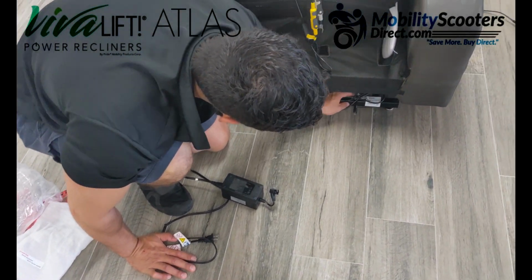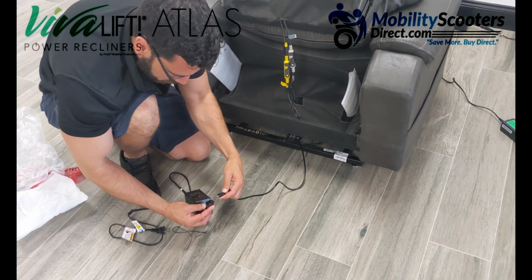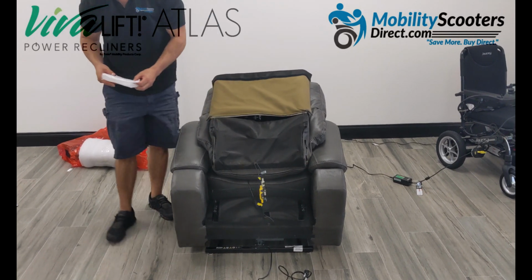It's only meant to be used to get you out of the chair in the event that there's a power outage. There's no wrong way to connect the transformer. Just find that cable attached to the frame and plug it into the receiving harness connector as shown.